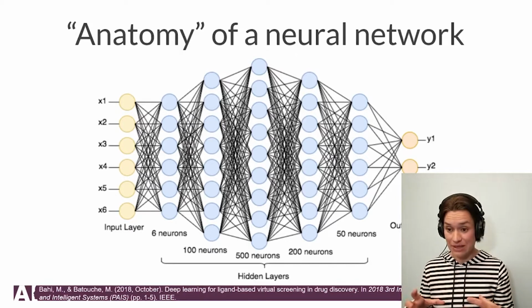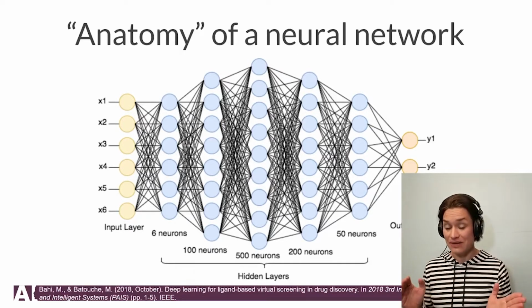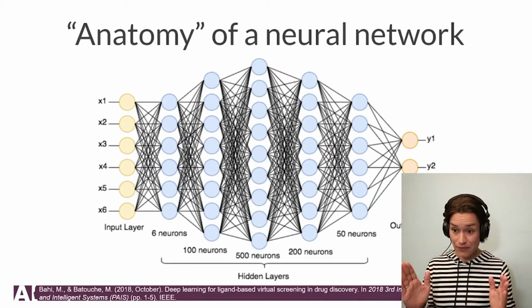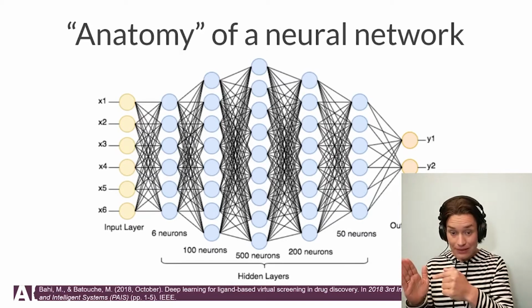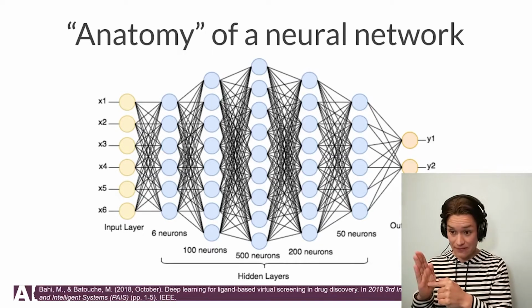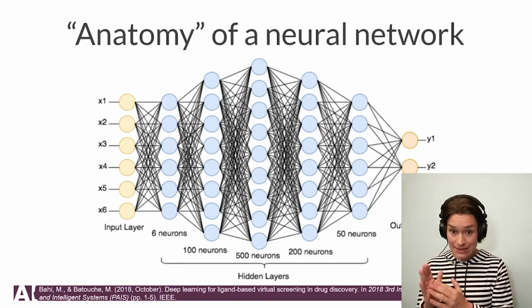And those weights are being adjusted. At the beginning, it's random, and then they are adjusted to give something meaningful. And how is it happening? There is a forward propagation of information from the native image to the output layer. And then the output layer is back propagating this information, moving the information back to compare to what we have given it. And if the comparison is bad, then the weights get adjusted. And if it's good, then the weights stay as they are.